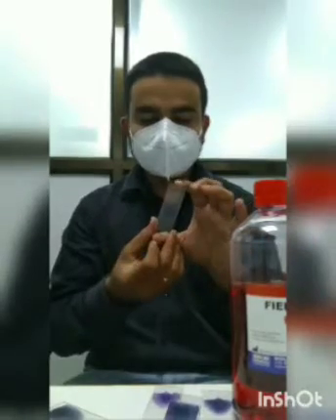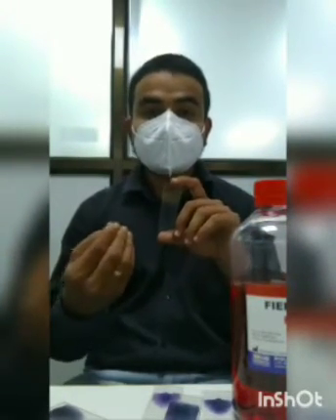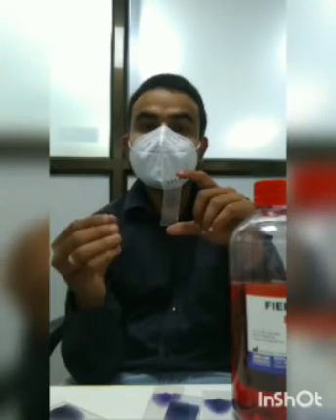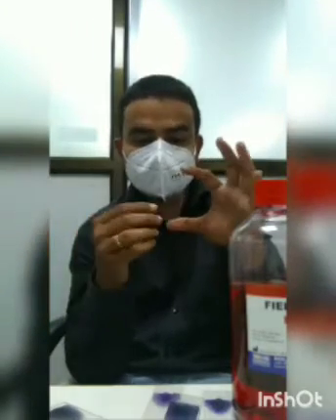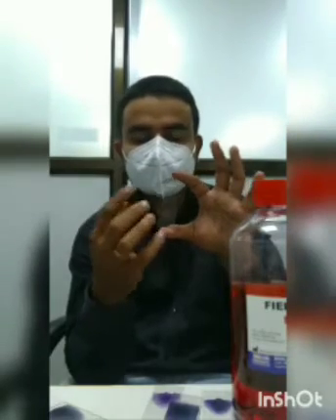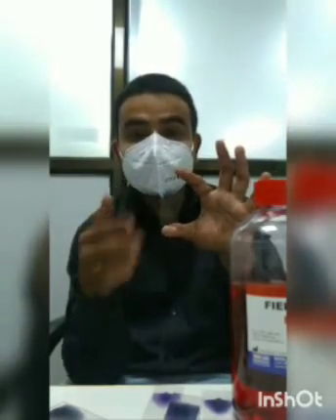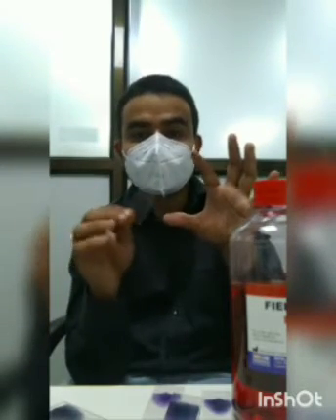So this thick smear is a more sensitive test to find out the parasite, for example, malaria parasite. Because here a lot of cells are overlapped. What we are doing here is we are preparing the smear, then we are breaking out all the red cells. We are dipping it into water.